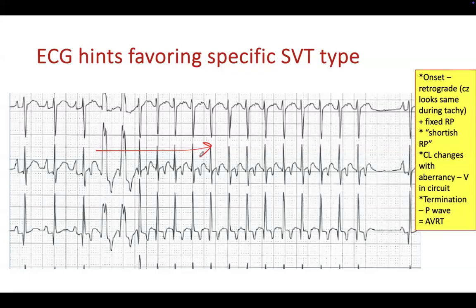Okay. That's another example of a wide complex onset and then it narrows down to narrow complex. It's a complicated tracing, but the point is wide to narrow is SVT, not VT plus SVT. It's unusual. Terminates with the P wave is against atrial tachycardia. Okay. And so forth. So another example of an accessory pathway mediated tachycardia, or re-entry tachycardia, but that's not atrial tachycardia because it terminates with the P wave. Okay. And sudden onset, sudden offset, regular.